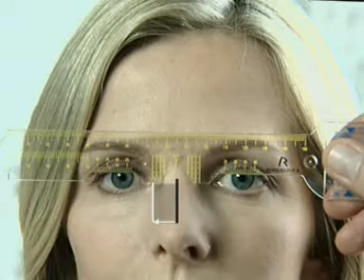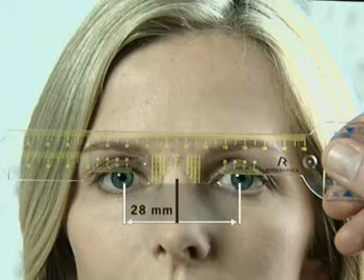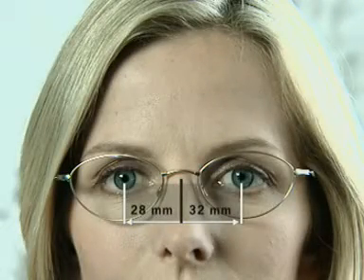Because the critical feature for the calculation of Impression ILT is the distance from the center of the frame to the center of the pupil. Equally important for the optimization of Impression ILT is the corneal vertex distance of the prescription frame, which can be measured at the side if the frames have only a slight bow. A simple method of measuring this is provided by the newly developed Rodenstock CVD ruler.